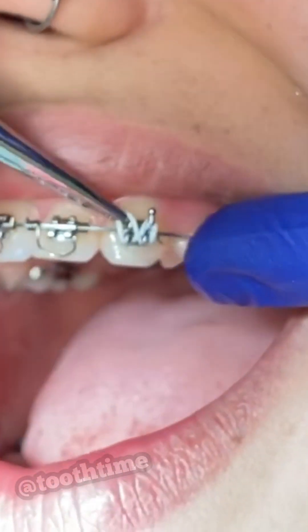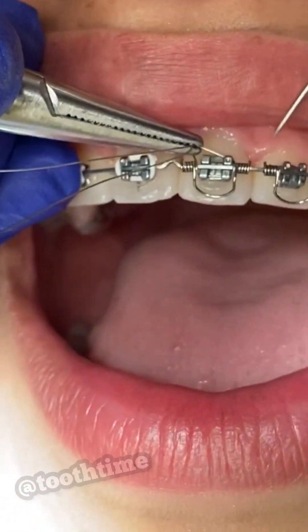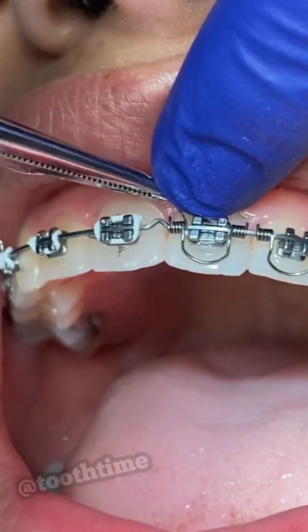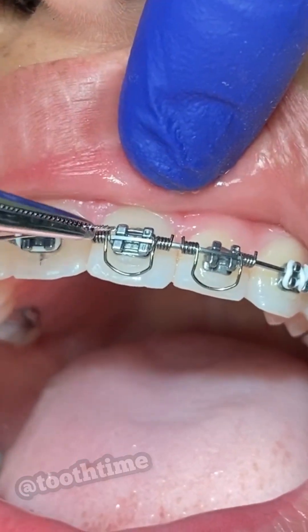Right now we're tying everything up really tight, making sure everything's engaged tight to the wire. This really doesn't hurt — it's more soreness that you might feel the day after, or some snugging and pulling during the procedure.